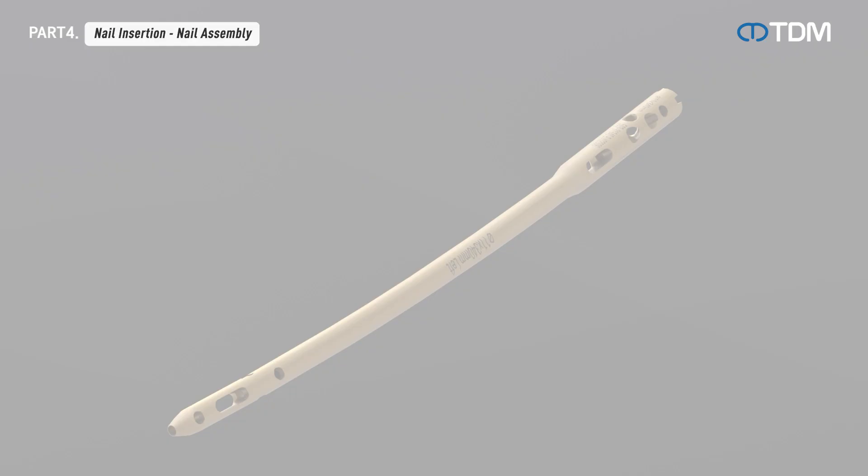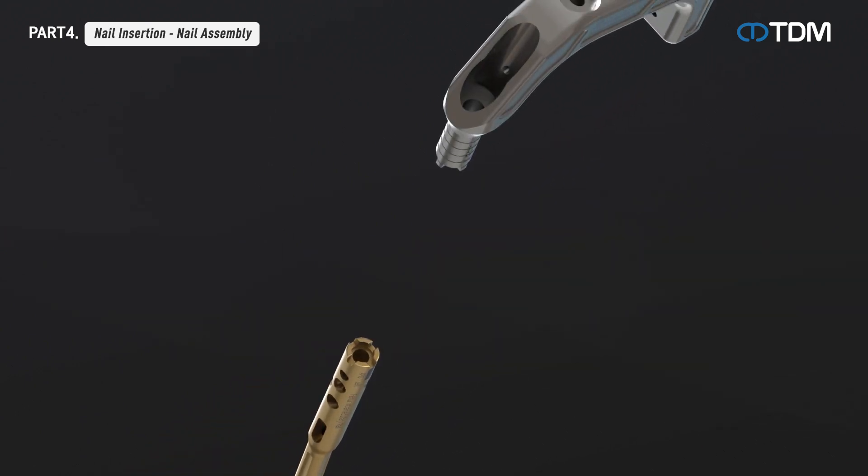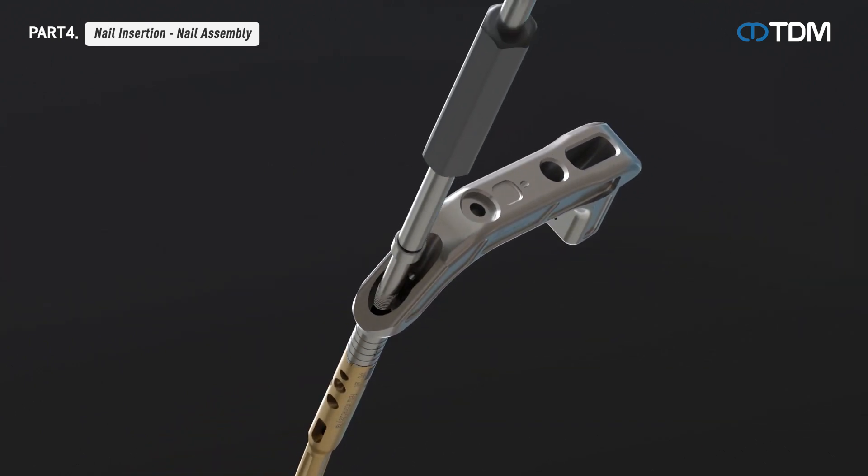Prepare a nail of appropriate length and combine the nail and the assembly handle in the correct direction with an assembly bolt.